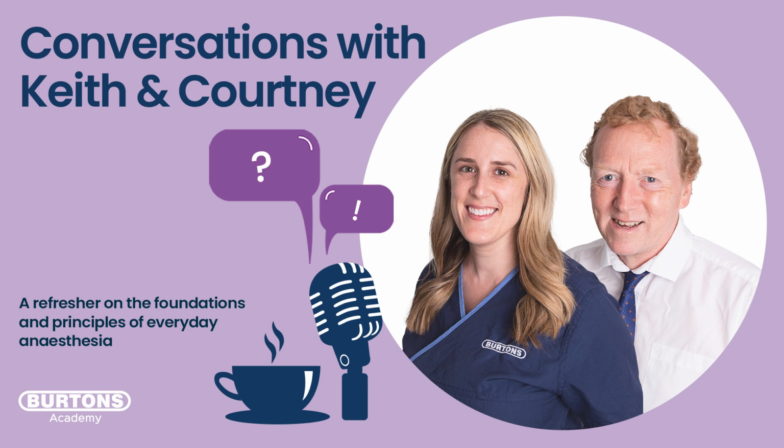Yeah, I really do like talking about pulse oximetry, and like you said, I need to not get carried away, because it would be great as a podcast. Keith and I have also put together a clinical article, I think sometime last year, on pulse oximetry. If you haven't read that, we can talk about it next time, and we'll link it into this blog as well. But pulse oximetry, I quite like pre and post anesthesia in regards to whether my patient's potentially hypoventilating.